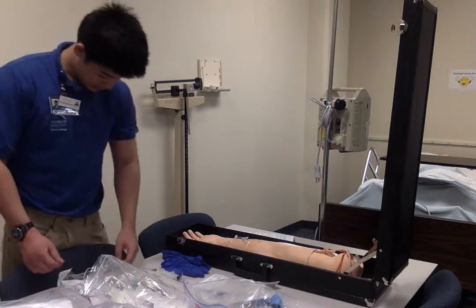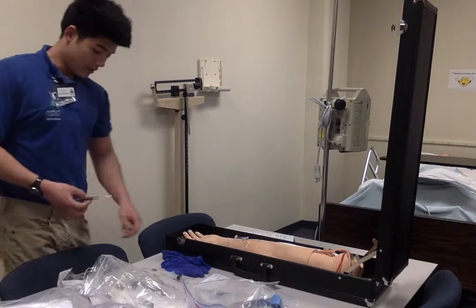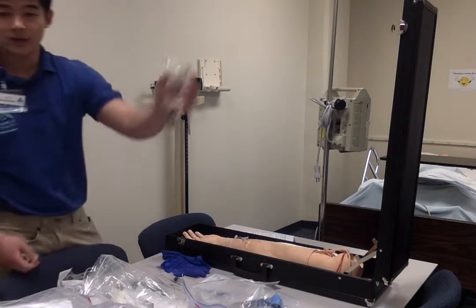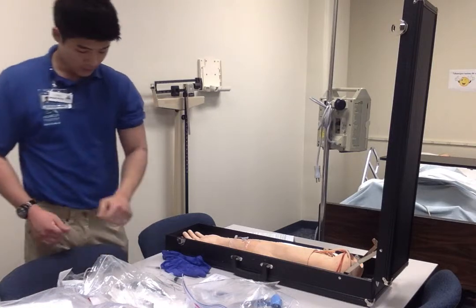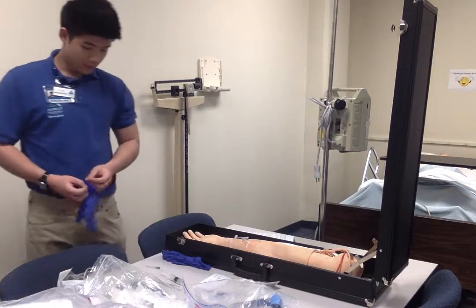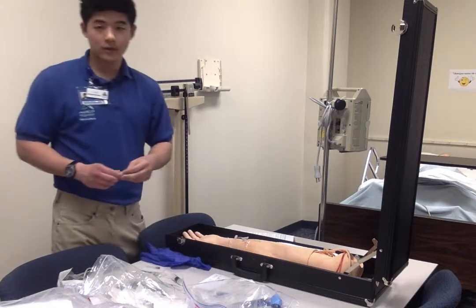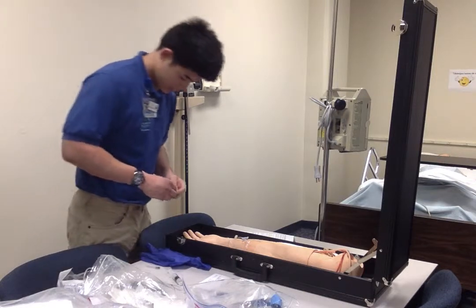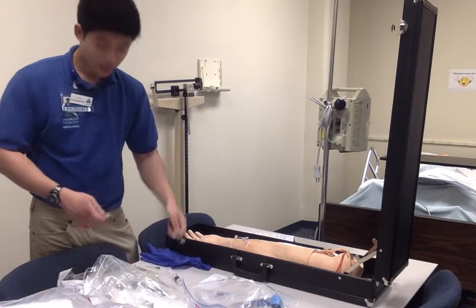Okay, so I pre-filled my medication here, 2 milliliters. Got my saline, 6 milliliters. And I'm going to assume that this is a 100 milliliter mini bag. Okay, so let me do my hand hygiene first. Put my gloves on. Well, I don't necessarily have to put gloves on, so here we go. What I'm going to do is have this bag and I'm going to clean it. And here we go.